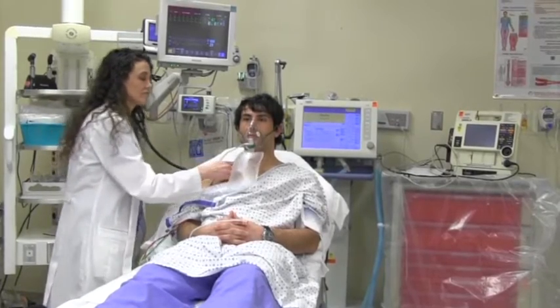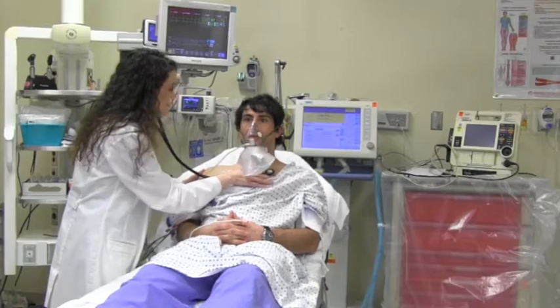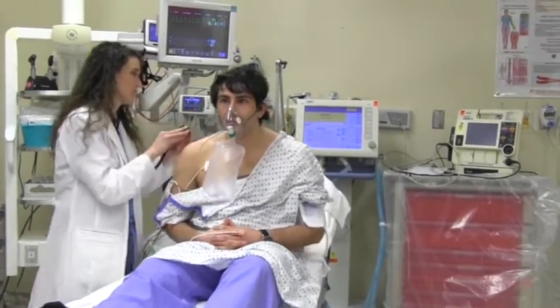I have a patient who presented with respiratory difficulty. How can ultrasound help you rapidly identify the cause of the patient's acute dyspnea? After pulmonary auscultation and a directed physical exam, optimal ultrasound scanning is achieved in the semi-recumbent position.